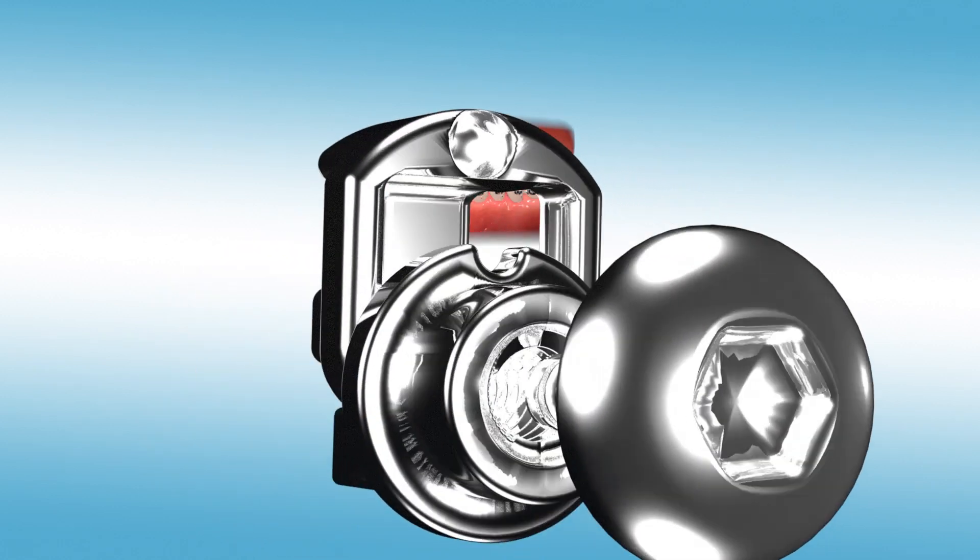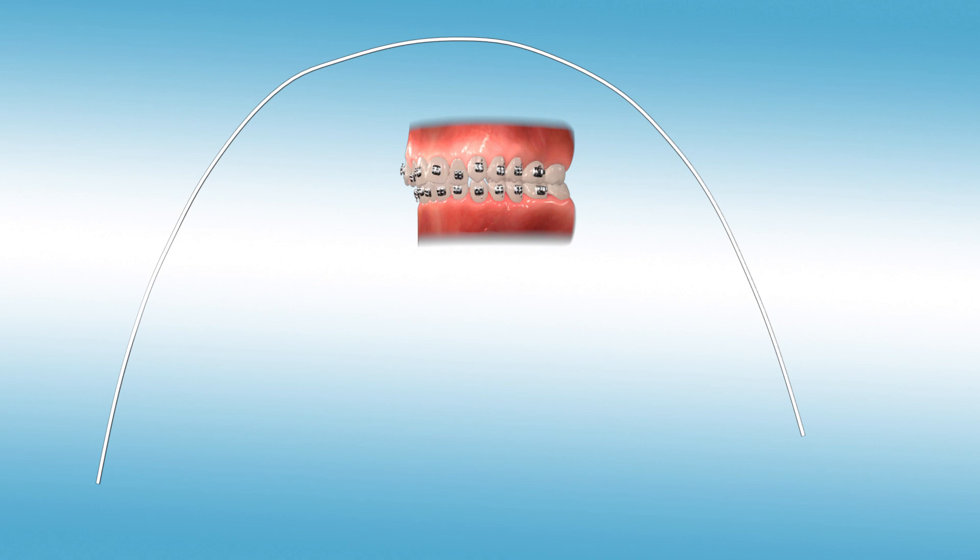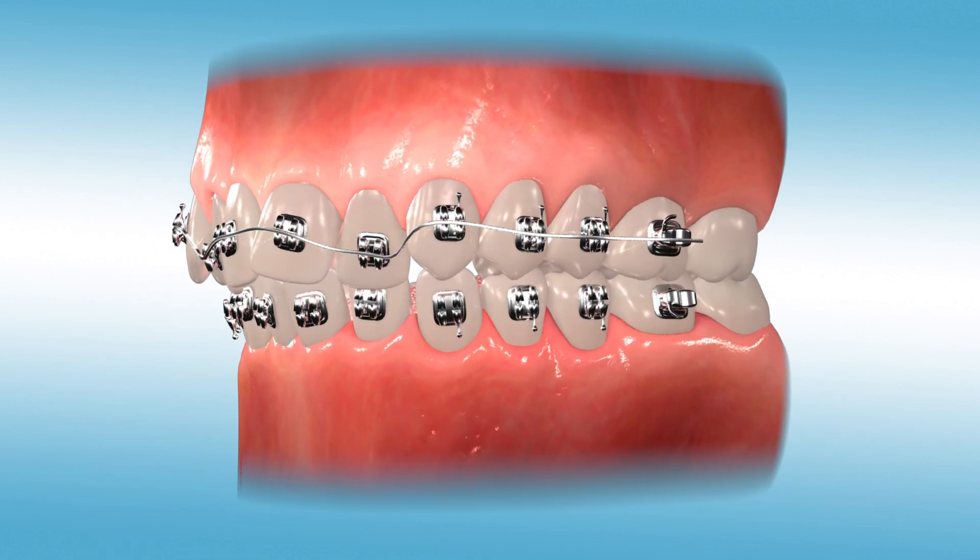The Dynaflex CS system with self-ligating pivots, as a Class 2 corrector, helps to retrain the lower jaw to bite forward without removing the arch wire.